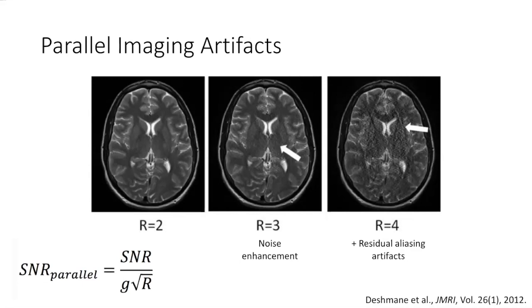And here's one I think you're probably ideally suited to answer as well. So why do we use multiple receive coils but not multiple transmit coils? So in practice, for anybody that's scanned on Bay 1, Bay 4, particularly at 3T or lower, multiple transmit coils are rarely used.